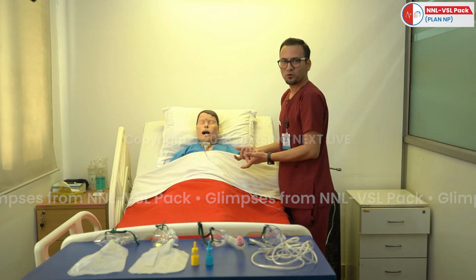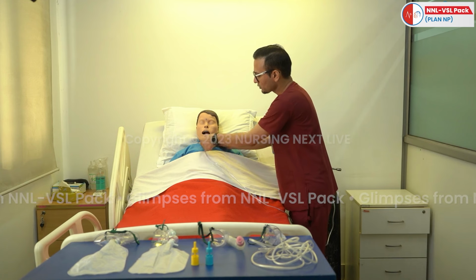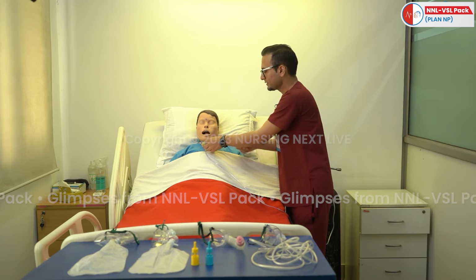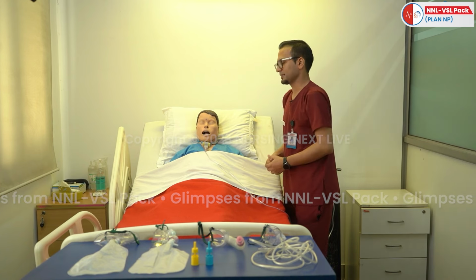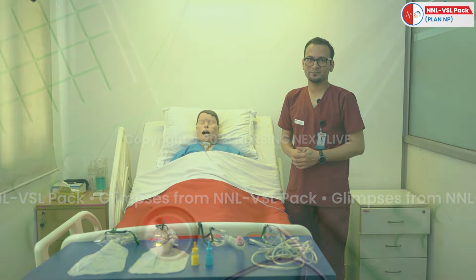And if you want to perform the suction, for example, this patient is having an excess amount of secretion, we can open this port and we can perform the suction over this area. So this mask is having multiple functions, so we can deliver the high concentration of oxygenation with the help of this mask. So this is all about the hydro track and high flow oxygen devices.